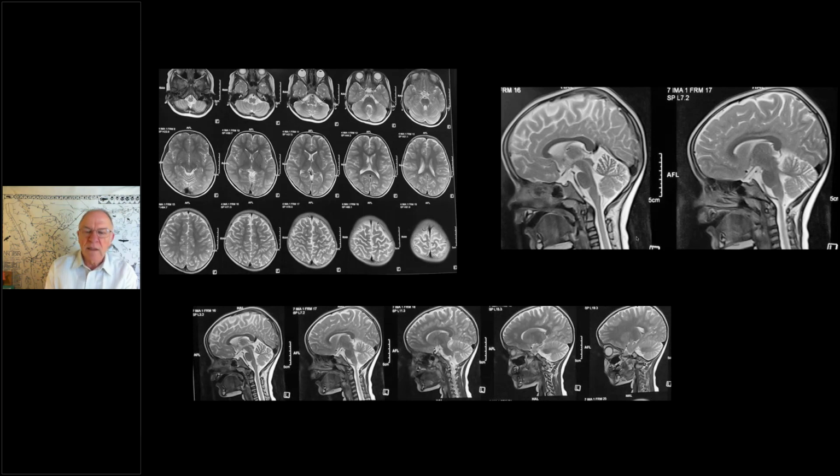Nihaal, can you comment on a sagittal brain MRI on a cervical cord? You often see that sort of apparent thinning, because you need a proper cervical image, right? Yes, the axial and the sagittal. Cervical cord thinning, along with cerebellar atrophy, would point to ARSACS, autosomal recessive spastic ataxia of Charlevoix-Saguenay, which is of course rare.